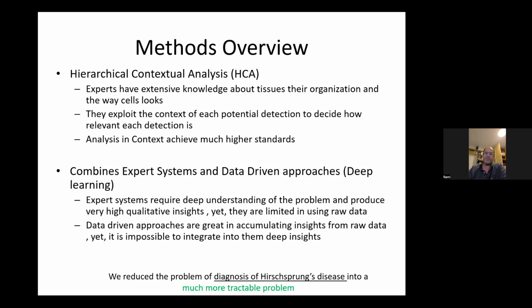So we reduce, for example, a case with 70 slides, which is equivalent to a 2 hour movie, full HD, 30 frames per second, into a single PDF, which tells the physician, this is the suspected ganglion cells, this is their location, this is the way they look, this is how confident we are that this is actually ganglion cells. And the moment you provide such a thing with almost no cost from the perspective of the physician, you reduce the problem to something very tractable.